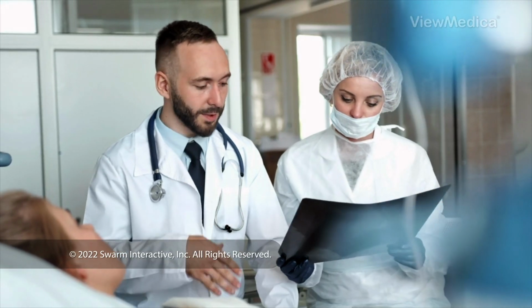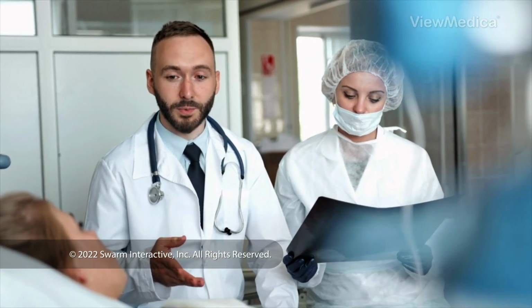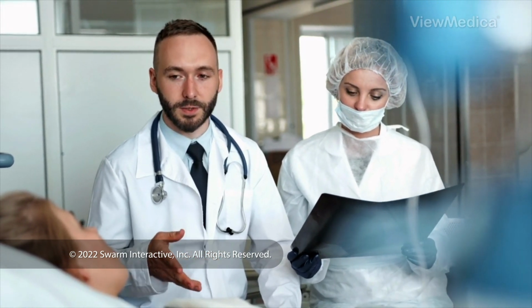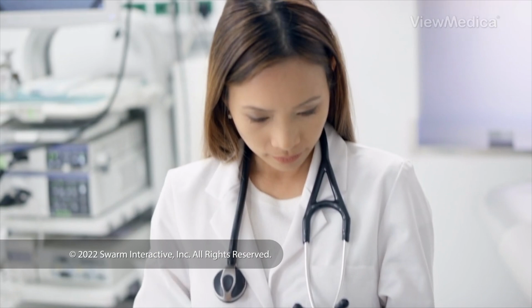When it's done, we close your incision and bandage your shoulder. You're watched closely as you become awake and alert again. Follow your care plan for a safe recovery.